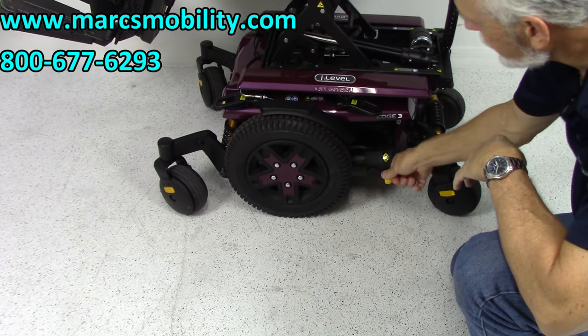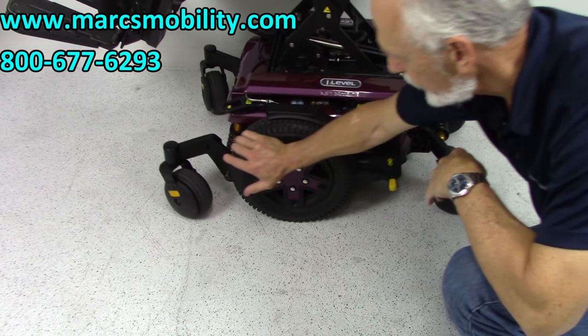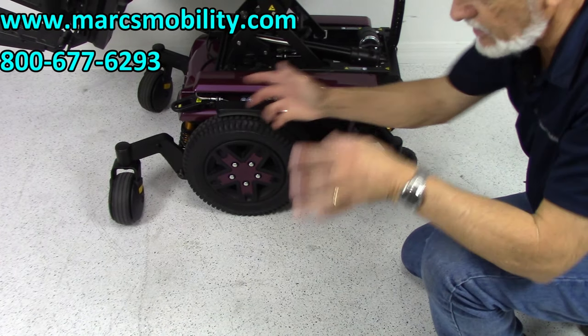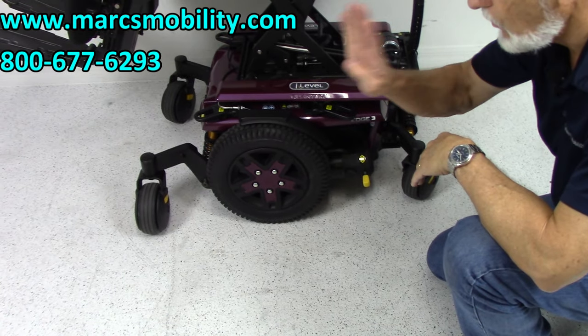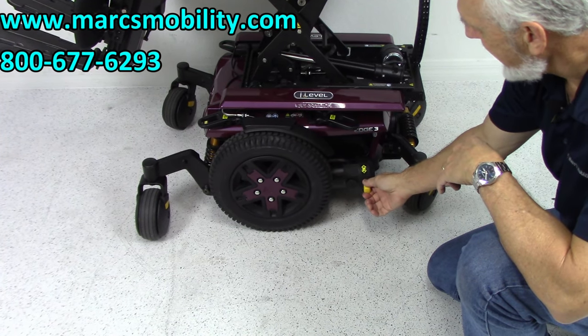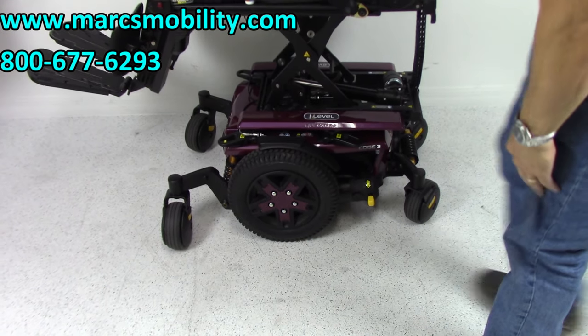I'm going to put this motor in neutral right here, and you'll see how easy it is. Now with one hand I can move the wheel. You have to do both sides and then you can push it around. But this chair does weigh 400 pounds. Put it back in gear, turn your power back on, and you're ready to go again.